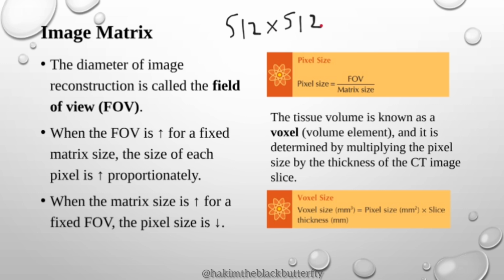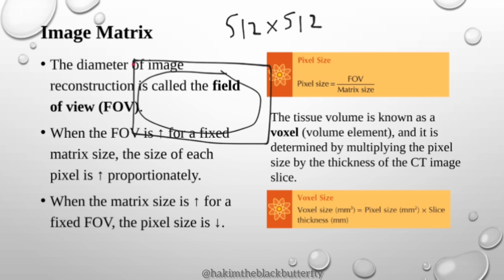If your matrix is like that, and it is displaying, if this is your anatomy, all this section of anatomy, but then you want to increase this field of view.